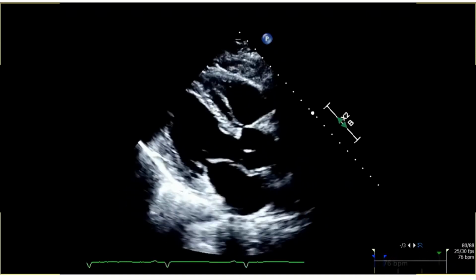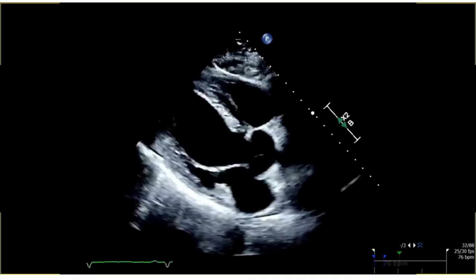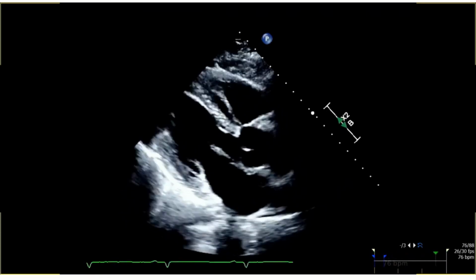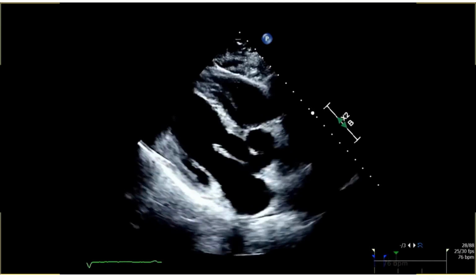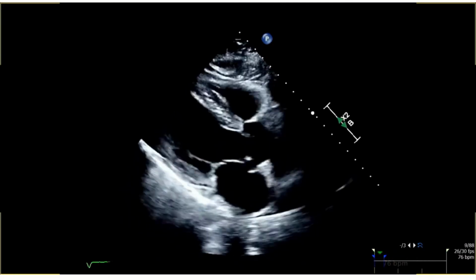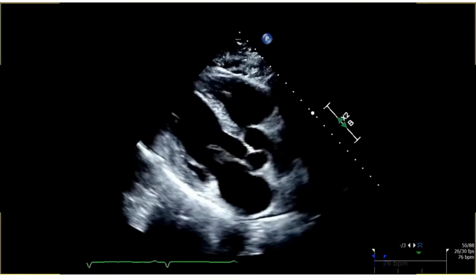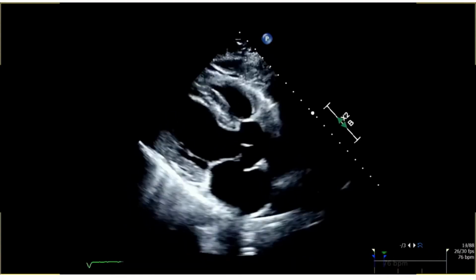There is no aortic stenosis, no aortic regurgitation. There's nothing happening; this aortic valve is normal. There is also the mitral valve, which is moving, opening and closing in diastole. The aortic valve is opening in systole, so that's why we have an EKG on every single echocardiogram. That also helps guide what we are looking at.